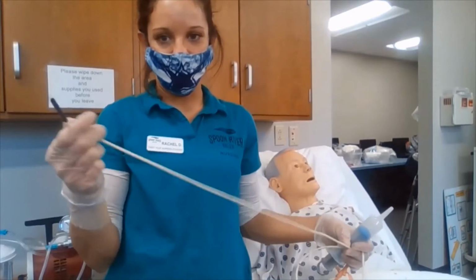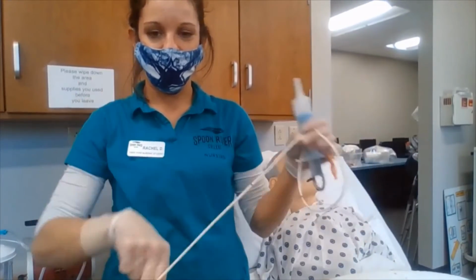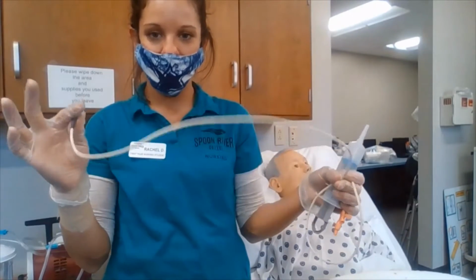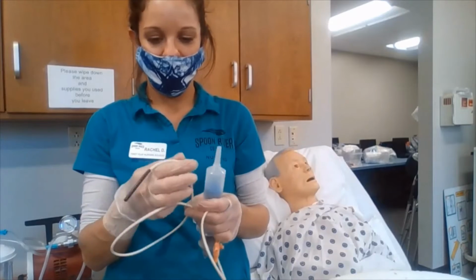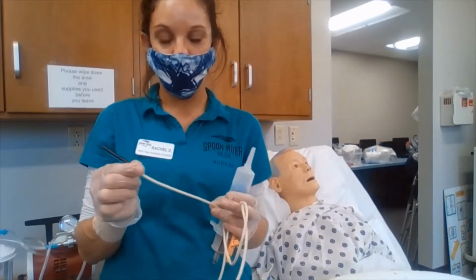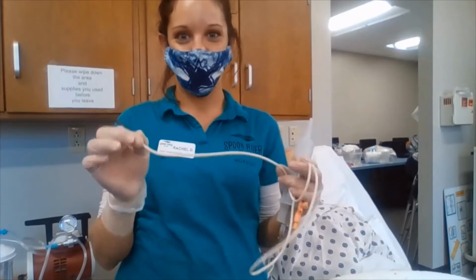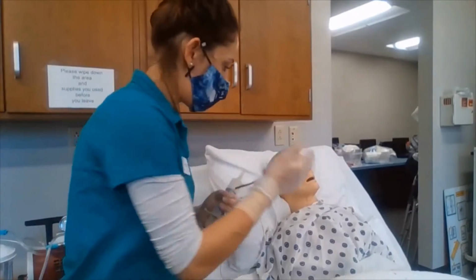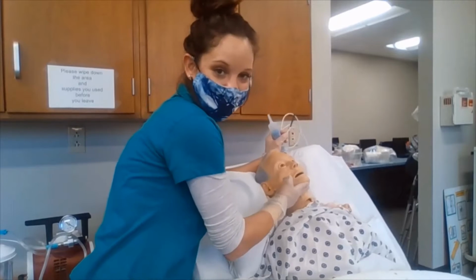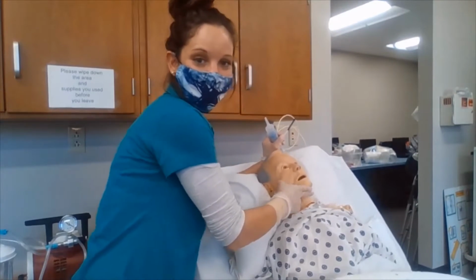So we are going to take our tubing and wrap it tightly around our fingers, about 5 to 6 inches, and then release. That helps with the flexibility of insertion. We lubricate about 4 inches down with water soluble lubricant. And we are going to ask the patient to hyperextend their neck so that their neck is extended back.